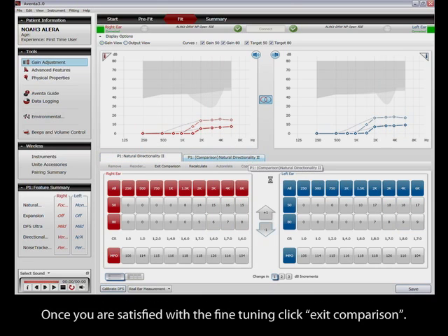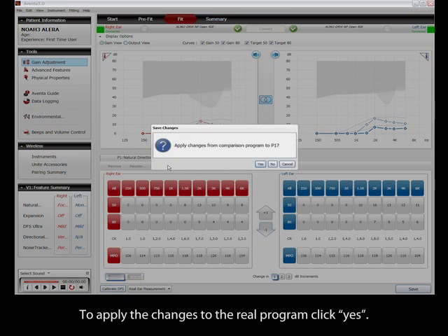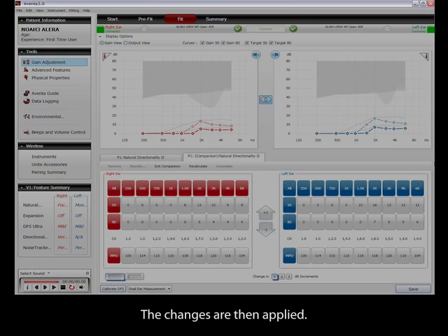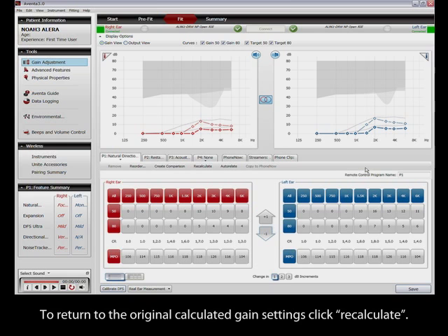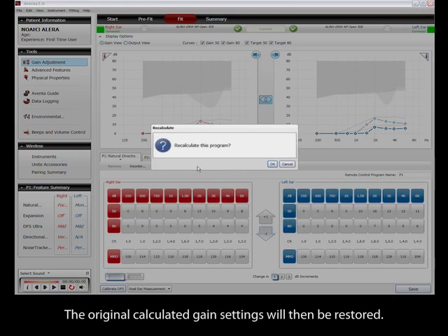Once you are satisfied with the fine tuning, click Exit Comparison. To apply the changes to the real program, click Yes. The changes are then applied. To return to the original calculated gain settings, click Recalculate. The original calculated gain settings will then be restored.